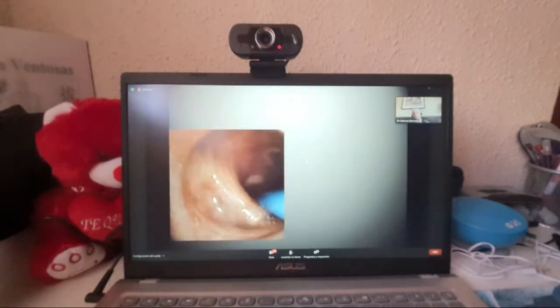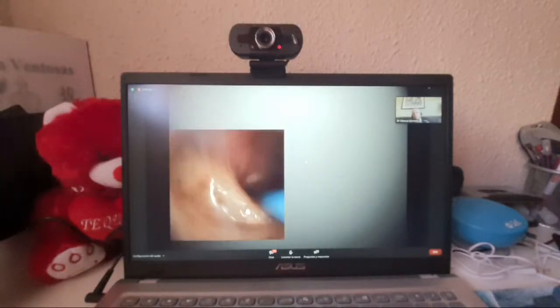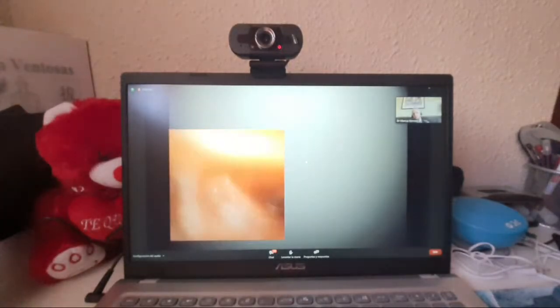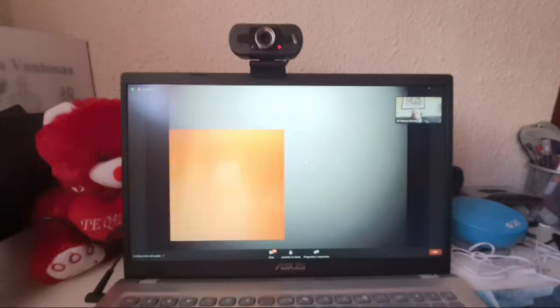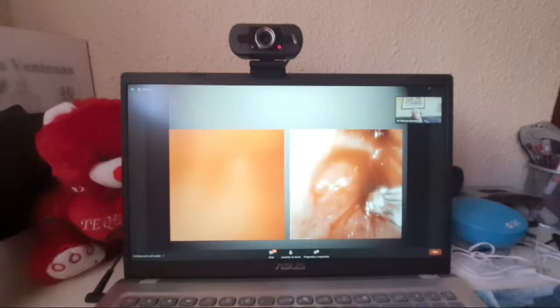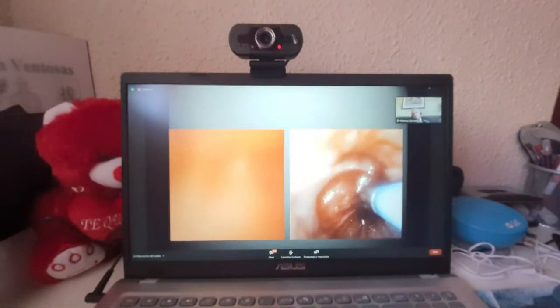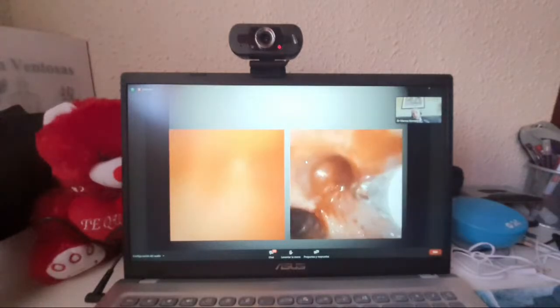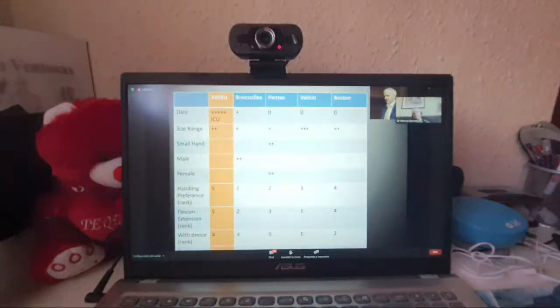So this is a transbronchial lung biopsy. We're putting the biopsy out distally. This patient's had a right middle lobe lobectomy. That's the stump on the left. We took a forceps biopsy. It's bleeding well, so we suction this blood and deal with it with a 2.8 channel. There was no issue here. It was suctioned out, maintained the airway, and sorted the issue out. Again, forceps out, tumor, taking a biopsy, 2.8 channel, Boston scope, biopsy, bleeding, able to suction the blood around the biopsy forceps. So that's very important.